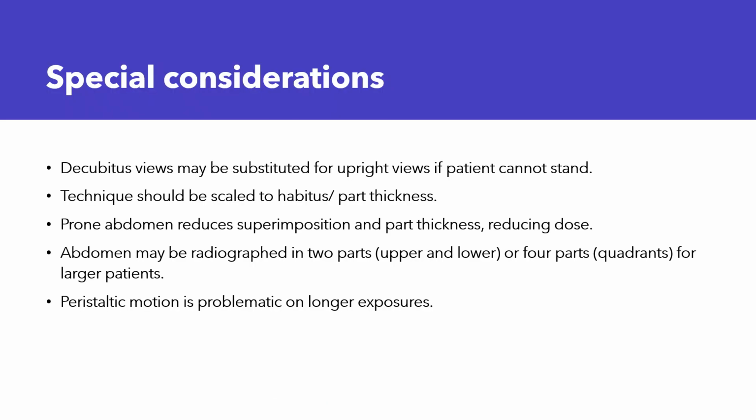All right, special considerations. Sometimes our patient can't stand up. So when our patient can't stand up, but they've ordered an upright abdomen, we're going to do a decubitus view. Now, what the hell is a decubitus view? I'm going to teach you that next time. Okay.